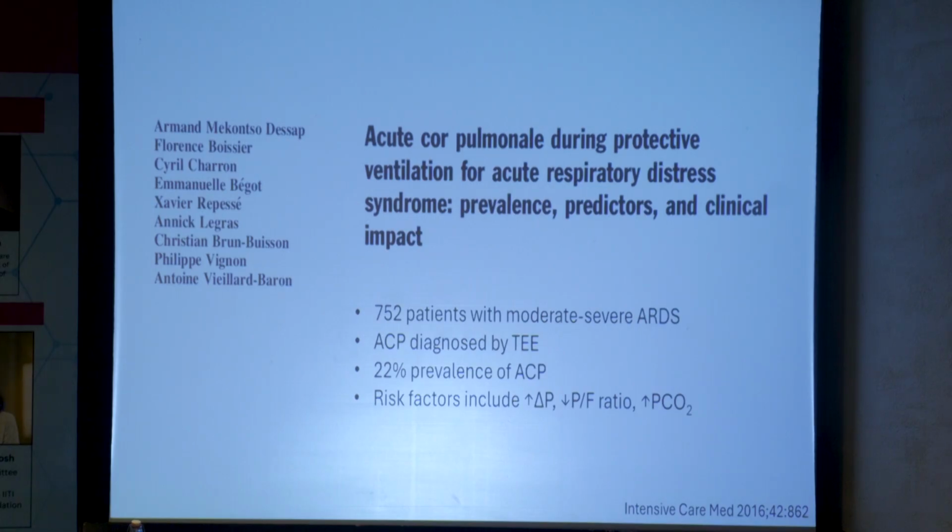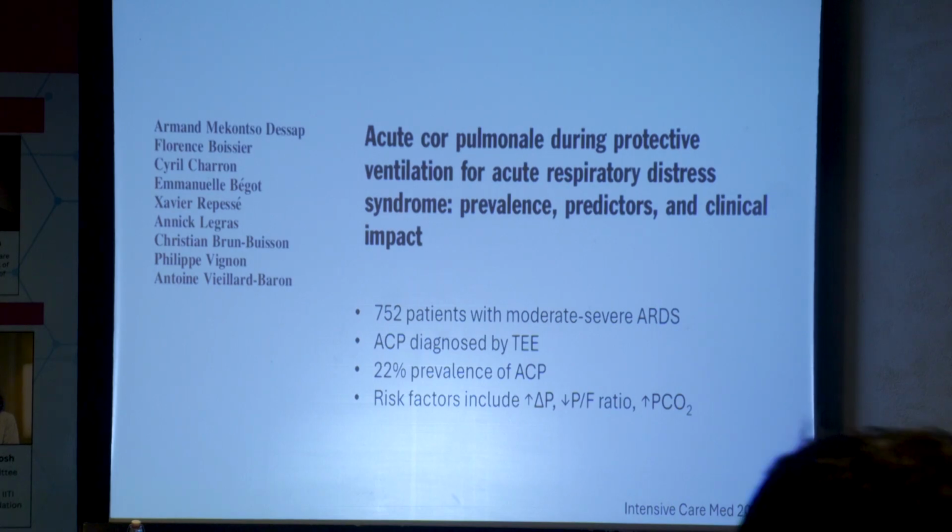So how frequently do these cannulas get blocked because of no flow or thrombosis? Very, very rare.